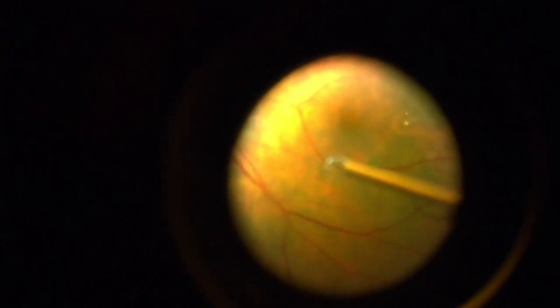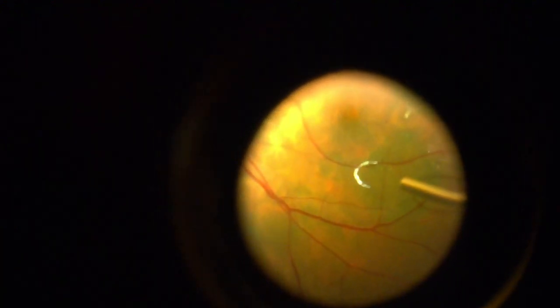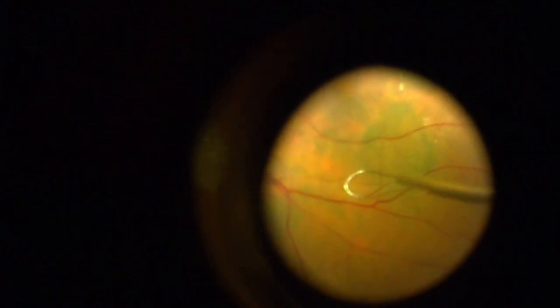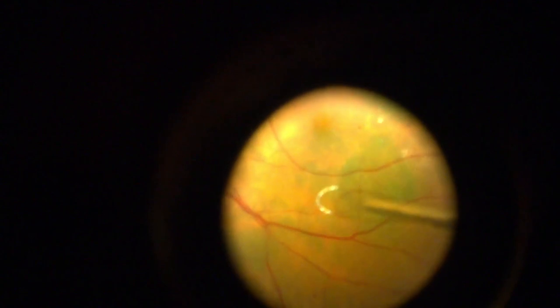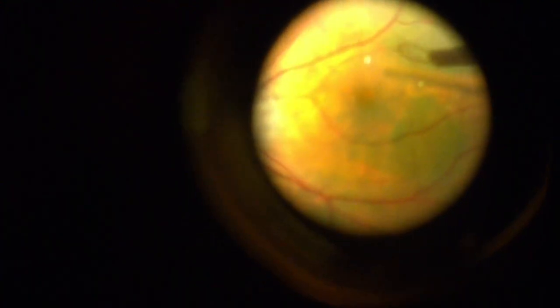So this loop scraper retracts in and out like this, and we can push it out so it's very flexible. And we can brush against the retinal surface to create an edge. And it's just starting there. And you can see how you can create an edge that way too. So now we got two edges that we started, right? One's right here and one's over here.